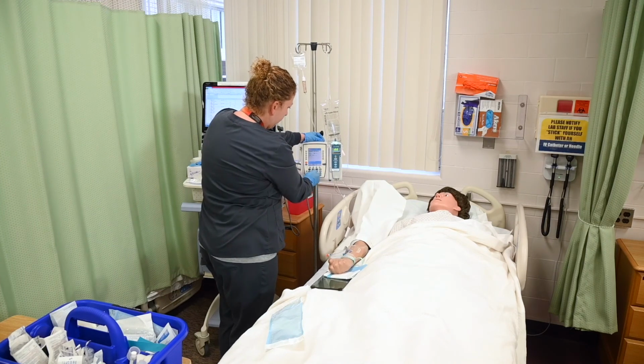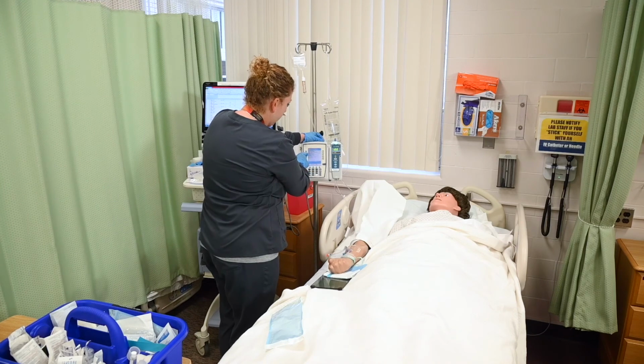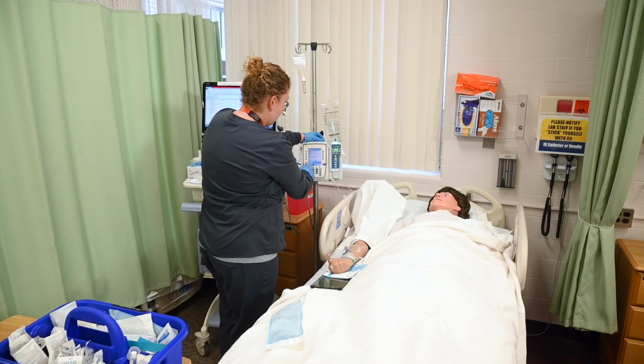Channel select, secondary. I'm going to find my medication. Choose the correct dose and volume. Verify that that's correct. Verify again. Press next to confirm. Verify the secondary clamp is open and then press start.